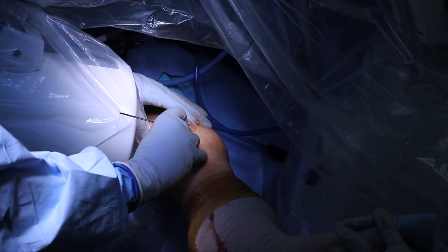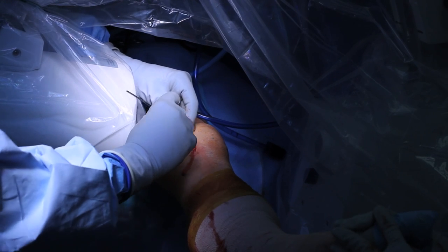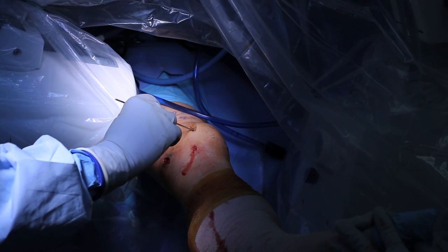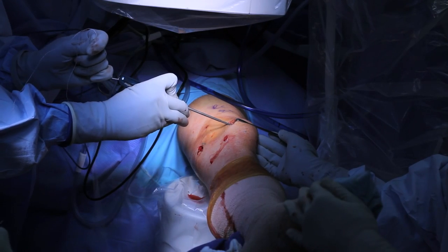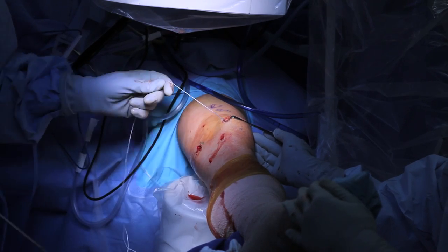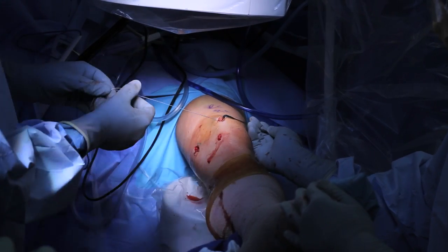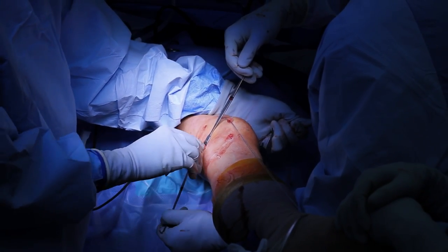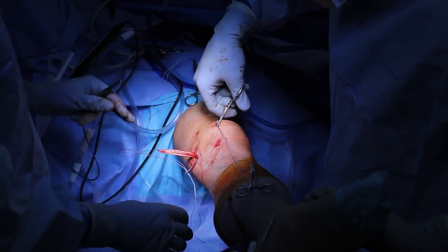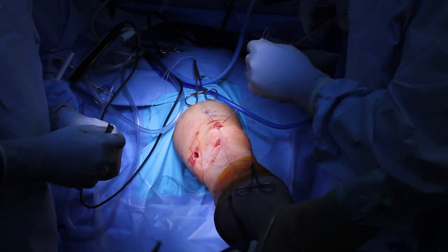The medial side of the patella is then exposed, and the bone is lightly decorticated to create a bleeding surface of bone on exactly the attachment site of the medial patellofemoral ligament on the kneecap. Two small suture anchors are then placed on the medial side of the patella to anchor the graft in place. The graft is then passed and seated into the femoral socket. The two tails of the graft are then seated on the medial side of the patella and sutured in place.